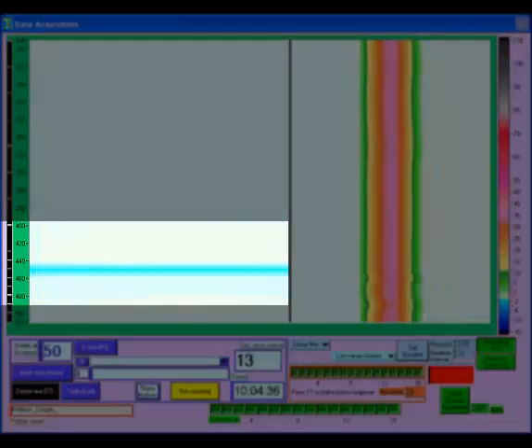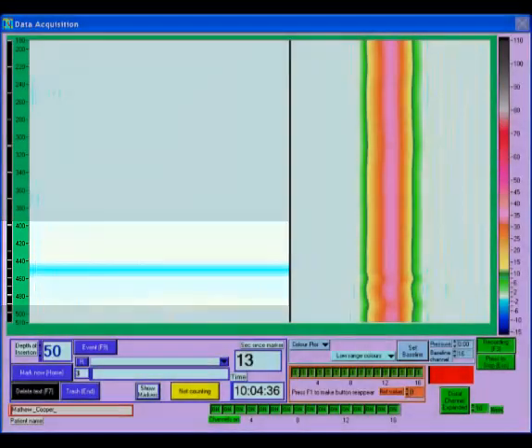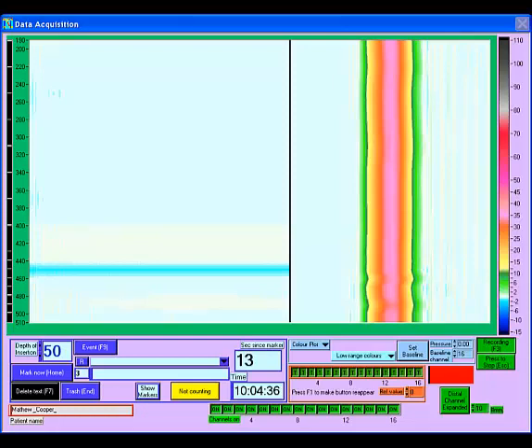the level of the channel. If there is some drift in a channel, you may need to flush the channel and can re-zero the catheter by pressing F1 on the keyboard to make the pressure reference button visible. Then press the button again, as has been done in the centre of this screen. A marker will be inserted and the background colour will return to white.